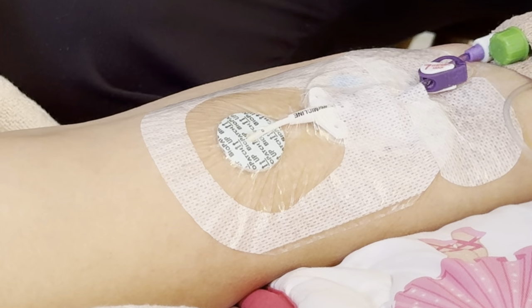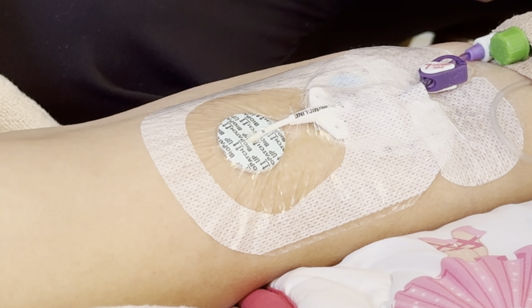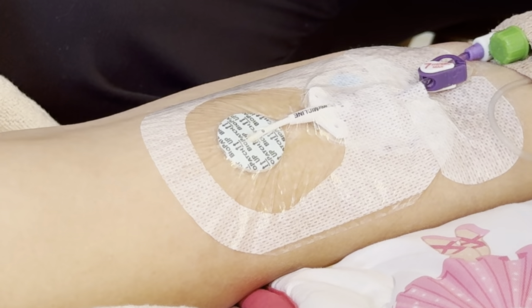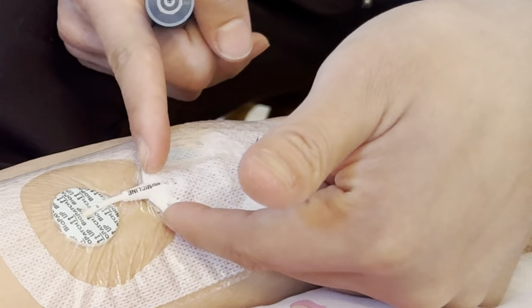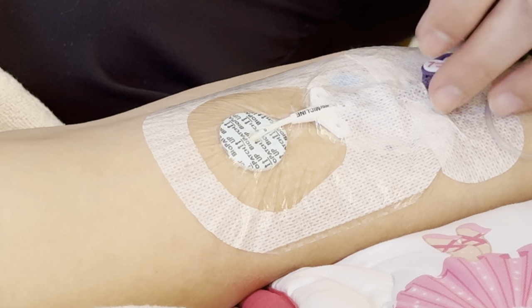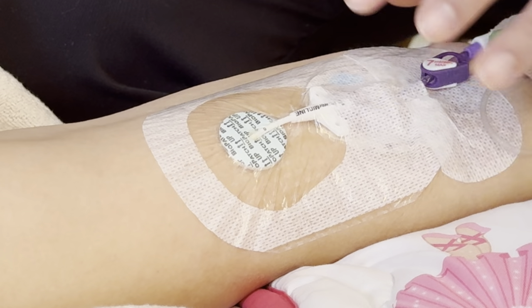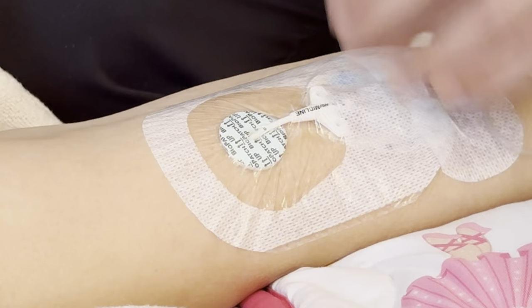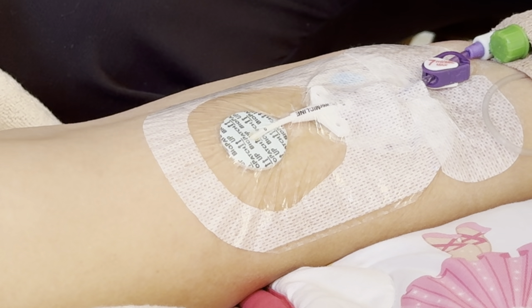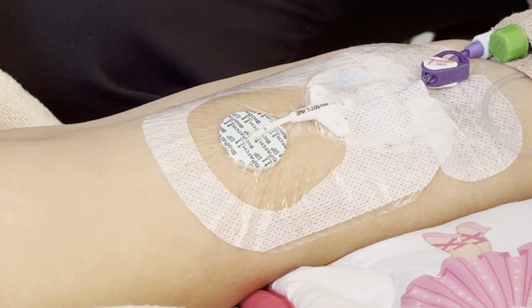So we need to disrupt the dressing. I'm going to get a detach-all so it doesn't hurt her — this is a fresh dressing and removing it is going to be painful. The patient reports that because the tail was pointed down toward the hand and distal, the bending of her elbow is uncomfortable because of the hardware in that area. Why they did not turn it up, I don't know — I can't find a good excuse for it. We're going to place it closer to the center of the green zone, pointed away from the flexion, so the patient can resume their ADLs comfortably.